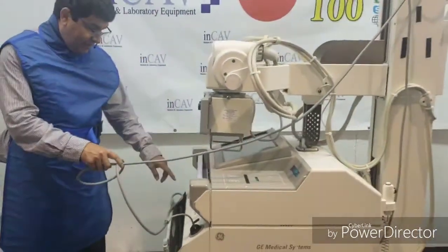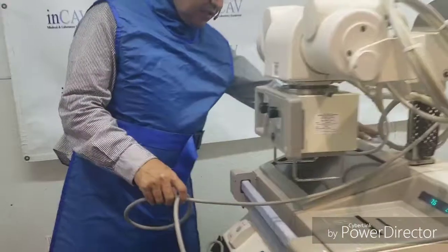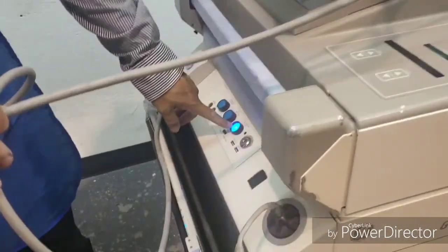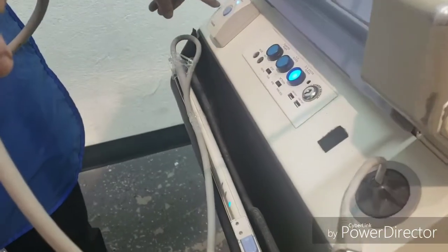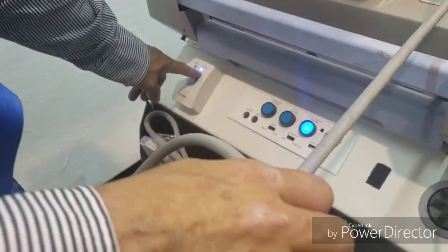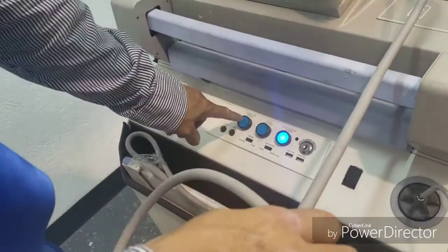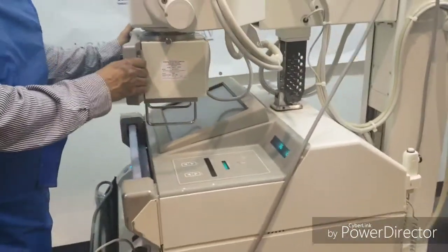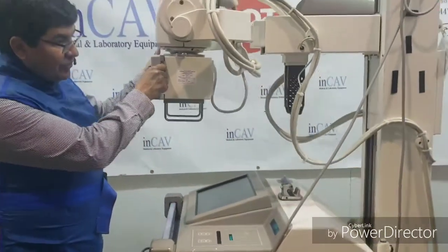First, we need to put on the system — the AMX4 — to put on the DR part. Be sure that the Canon detector is on and the computer is on. Now we are turning on the computer. Brakes off, so we can move.